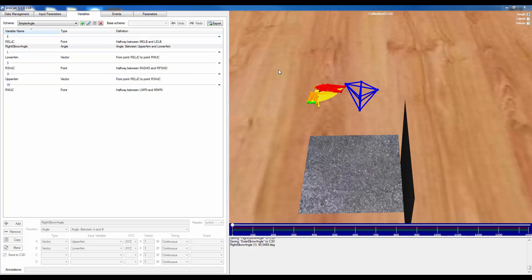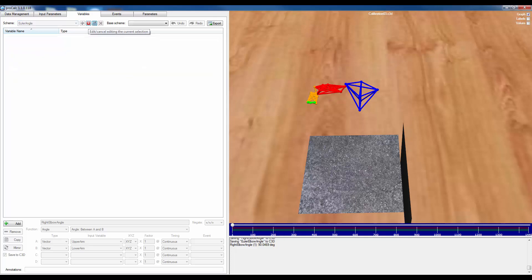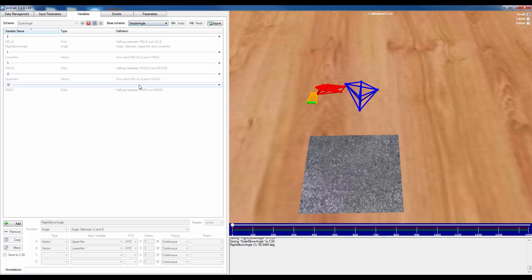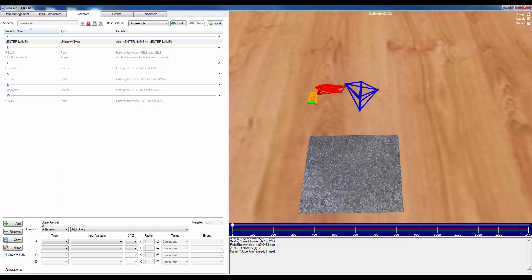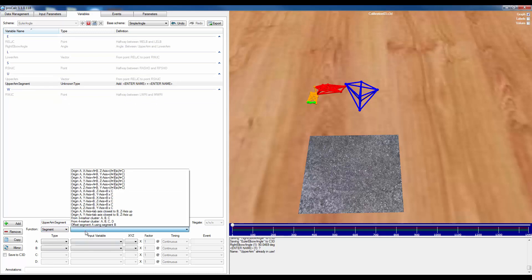To calculate a more complex Euler angle, I'm again in the Variables tab. I'll create a new scheme called 'Euler Angle', and instead of recreating some calculations, I can use that previous scheme as my base scheme so it already handles all the joint centers. This time I'm going to create segments for the upper arm instead of just vectors. I'll add an 'upper arm segment', select the segment function, and use points to create vectors and cross products to define a local coordinate system for the upper arm.